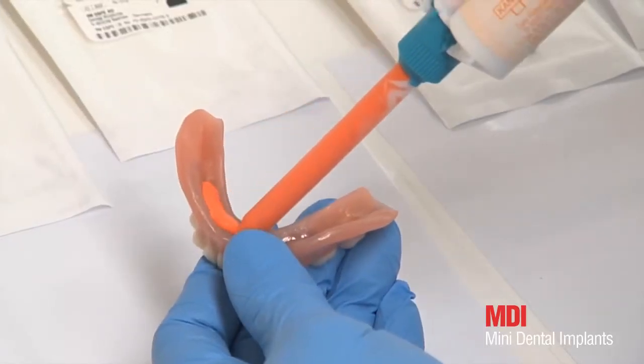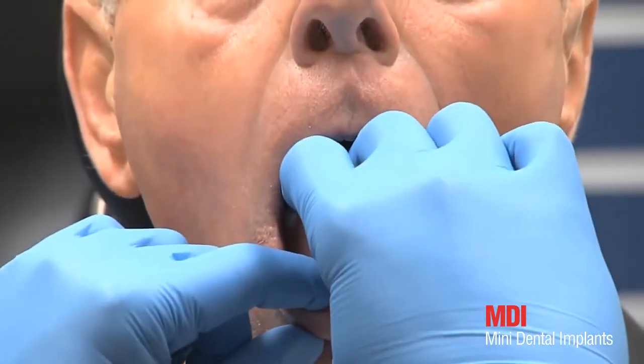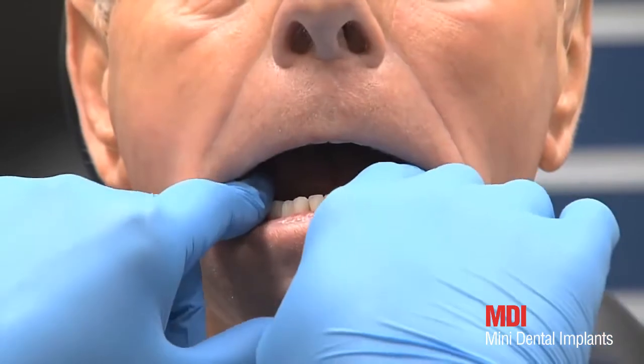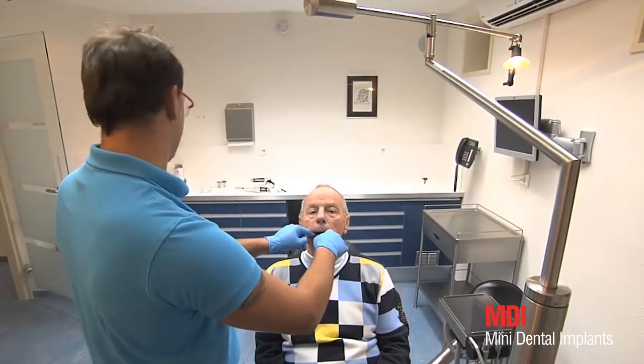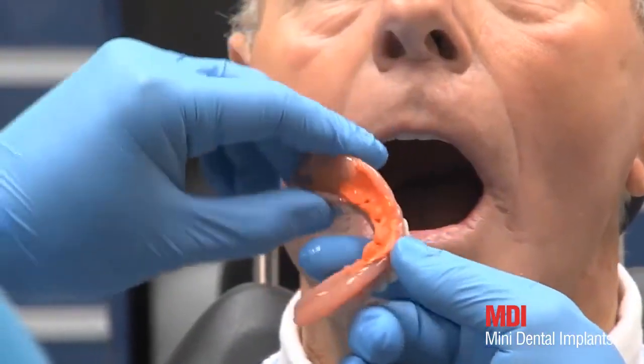The ground out prosthesis, prepared by the technician, is filled with a permanently soft silicon material — for example, Secure Soft reliner — and an impression is taken. The imprints of the ball attachments can now be seen clearly.